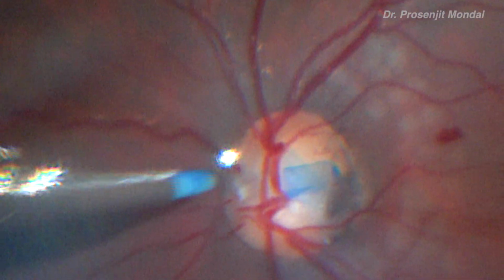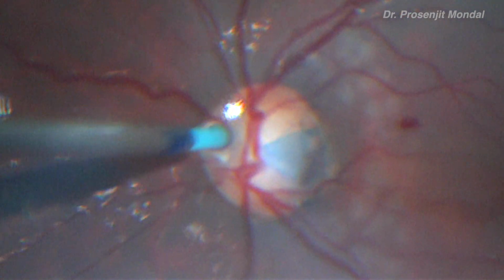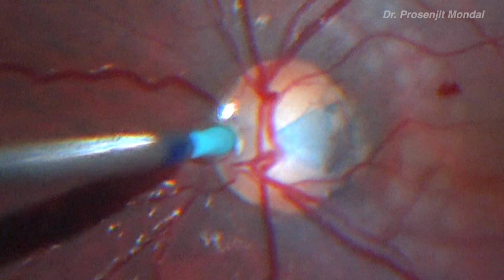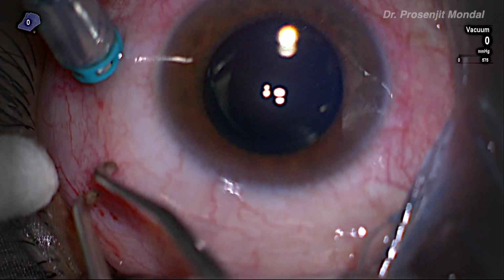Fluid air exchange is done very gently so that the flap remains in situ over the optic disc pit. C3F8 gas is injected, cannulas are removed, ports closed.